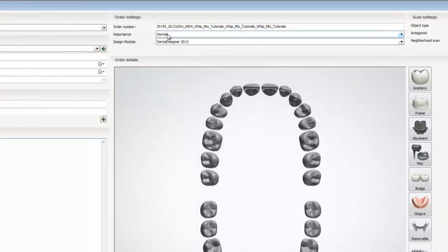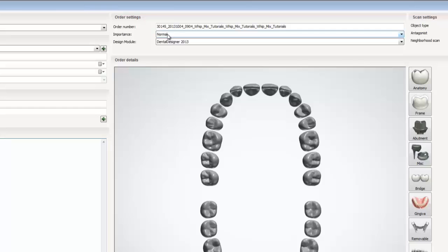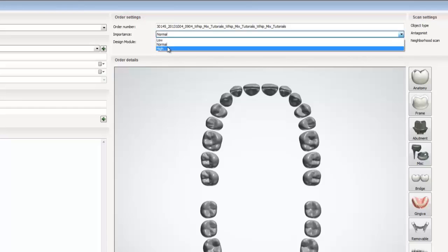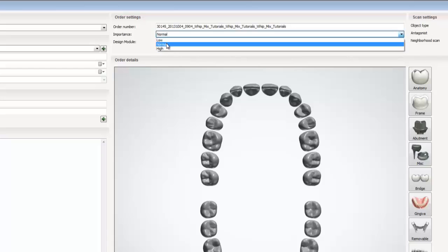Now let's take a look at the order settings. In the settings, it displays the case specific order number, the importance, and the design module. By selecting the importance drop down menu, we can change the priority of the case. Each priority has a different symbol displayed in dental manager.